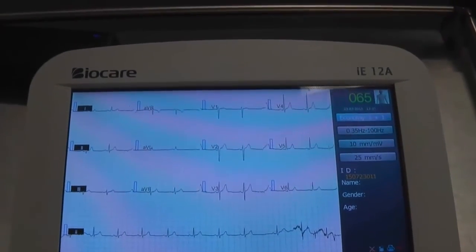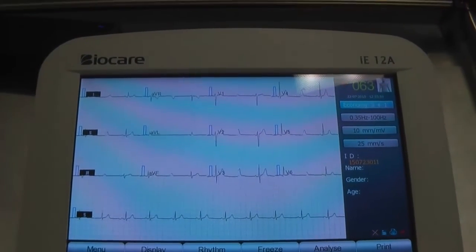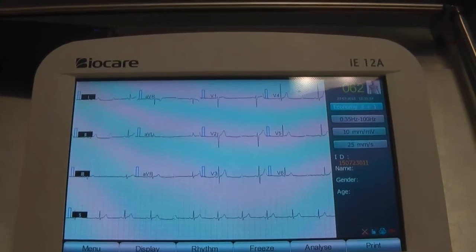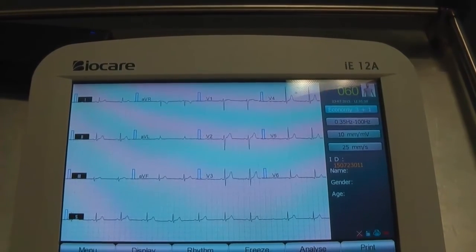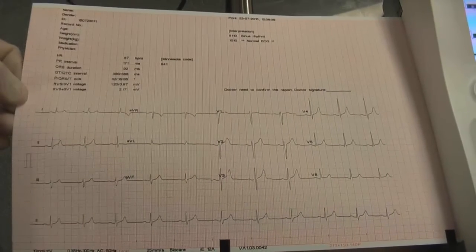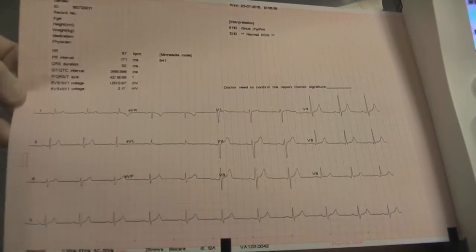Once we've got the previous screen being refreshed on the ECG, you'll see that the ECG is pretty near perfect. This is the result of a properly prepped patient.